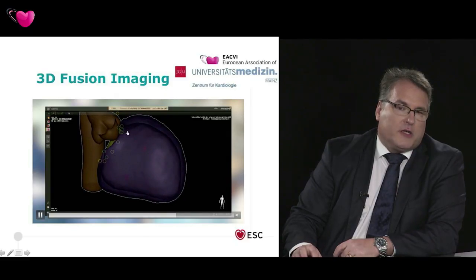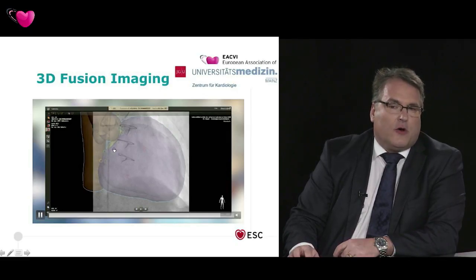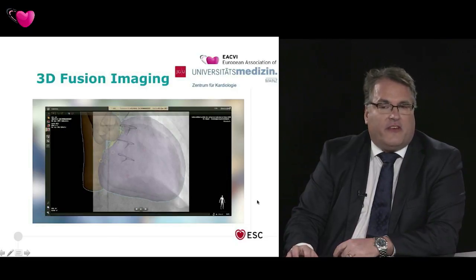And with the yellow spots, I always know how it's orientated, and you can then treat by either going to the aorta, here given in yellow, or by the caval vein, you can go up to these structures. So this is very, very telling.